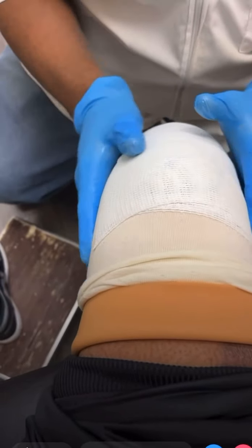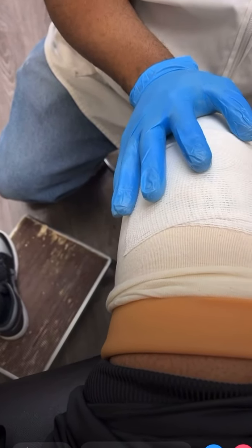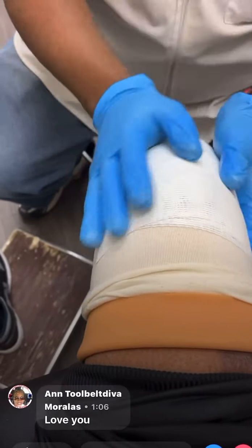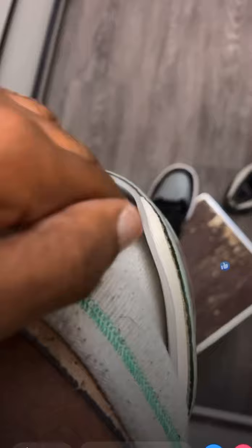So I had to find a better practitioner. Getting fitted for the new sockets. Time to start jogging around, step it up. See all the space in this, like with it on? See all this? It affects my quality of life, so getting new sockets.